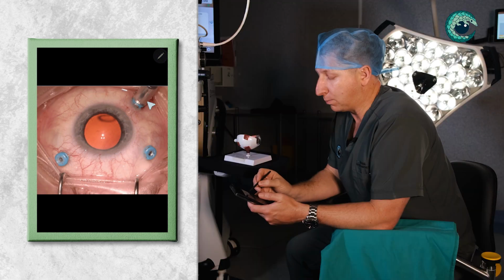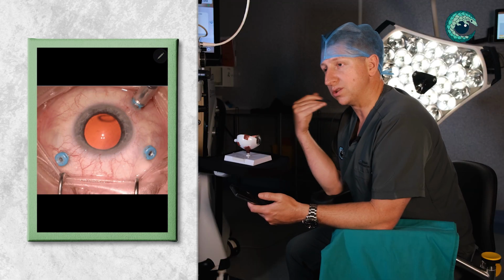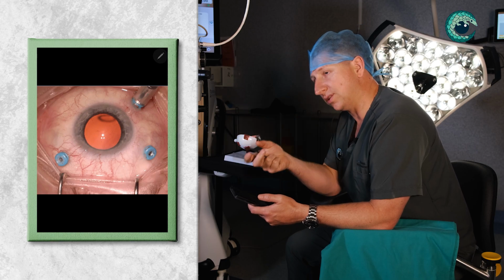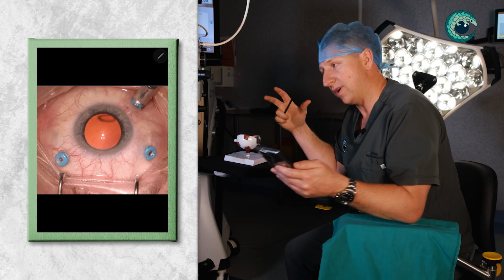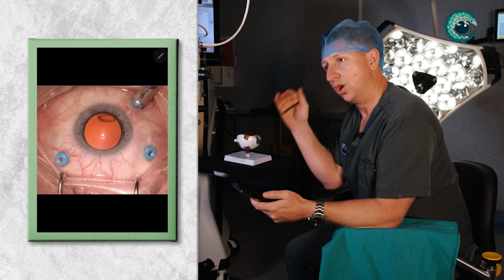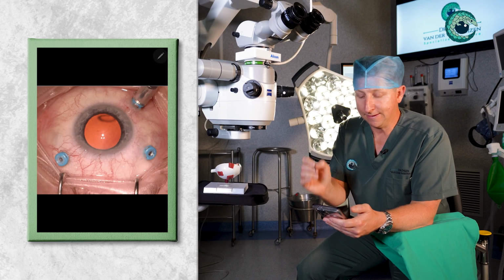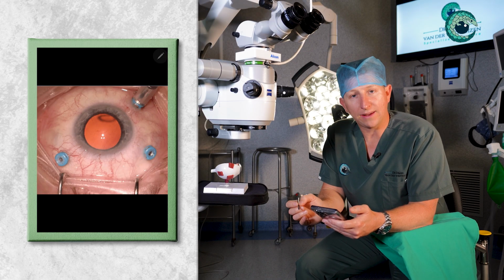One port is for irrigation. It constantly has fluid flowing into the eye because as you suck or remove something out of the eye, to prevent the eye from collapsing in on itself, you need to constantly replace that fluid. So this is what we call the irrigation line. On the other 2 ports is where we access the eye.